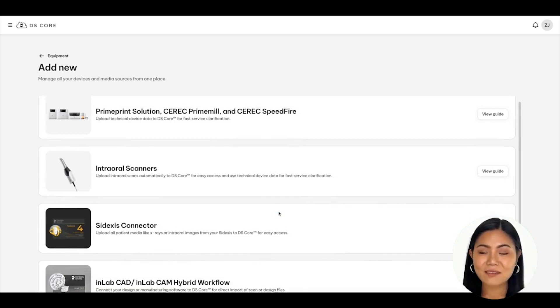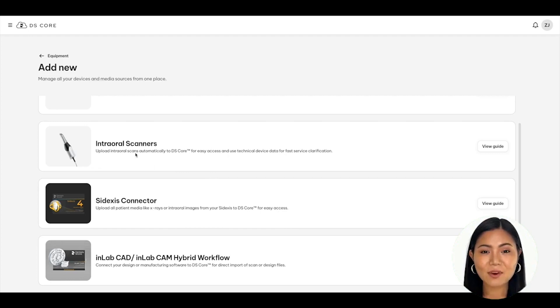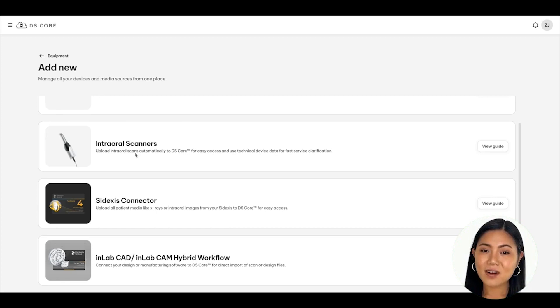Navigate to the new blue button and click on it to open a list of devices for you to connect. You should now see four different device options to set up: PrimePrint Solution, CEREC PrimeMill, CEREC Speedfire, Intraoral Scanners, Sidexis Connector, and InLabCAD/InLabCAM Hybrid Workflow. We are going to start by connecting intraoral scanners first, then X-ray Sidexis-supported devices second, followed by Design and Manufacturing third.